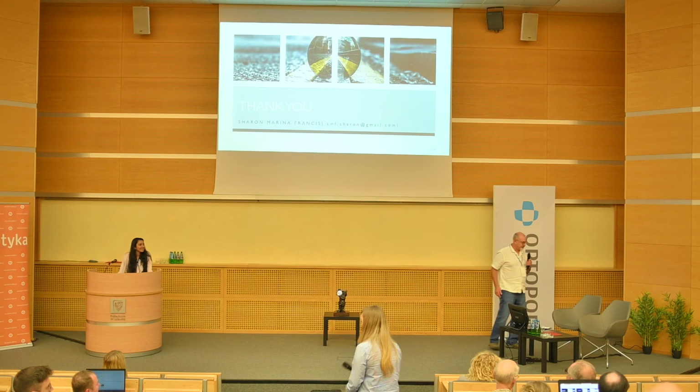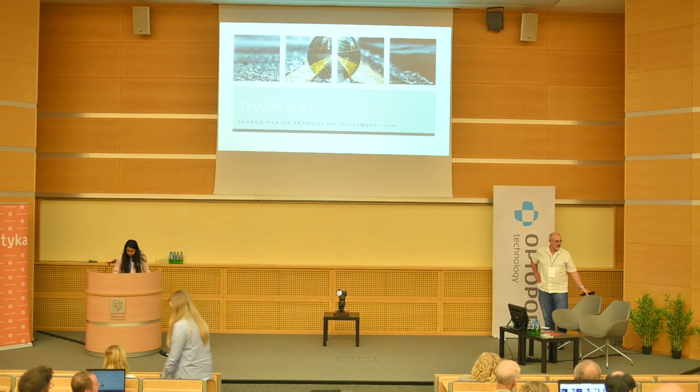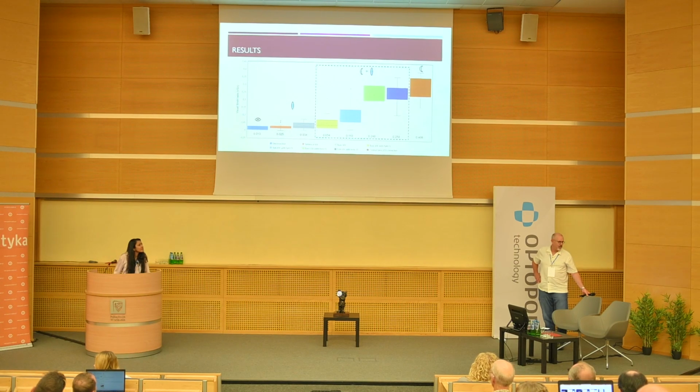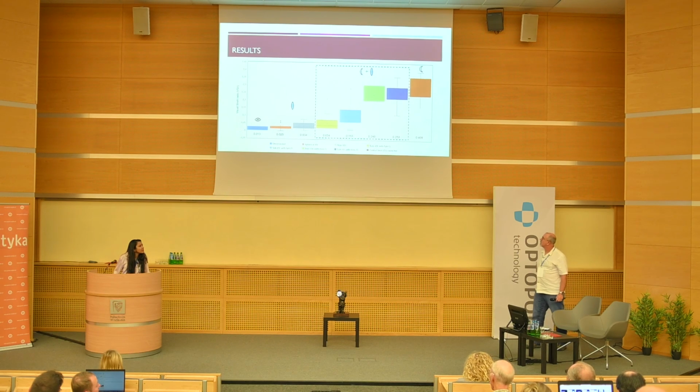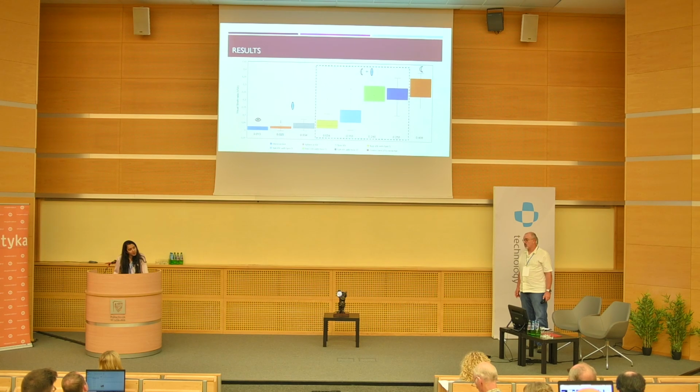Go ahead. So this is some simulation. If you can go back to slide number 10 with your results, I'm just wondering which parameters that you enter to generate those keratoconic eyes contribute mostly to this increasing variation in standard deviation. The VSX is calculated from the wavefront, the resulting wavefront from the eye. That's how the VSX was calculated.